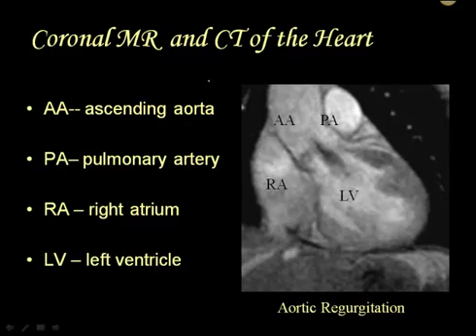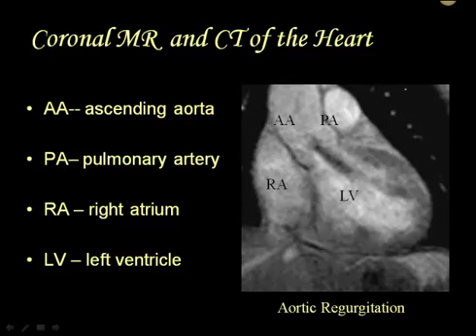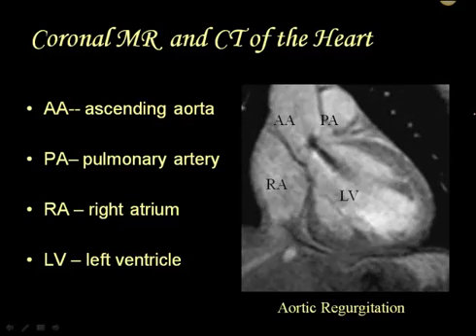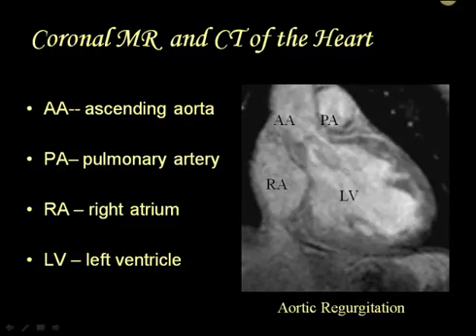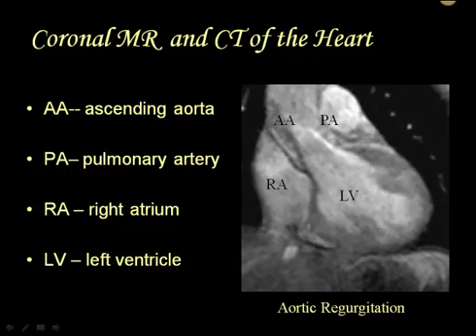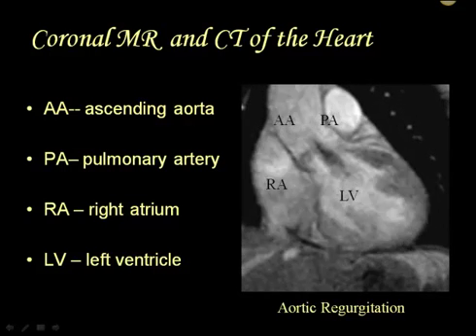Now, if you recall, I was talking about the Doppler effect being recorded on an ultrasound. Well, it's not exactly Doppler, but something rather similar happens with MRI in certain sequences that they do. And specifically, blood flowing in the normal projection shows up as bright. On the other hand, blood that's flowing in the wrong direction is showing up as dark, because really what's happening is it's not showing up at all.